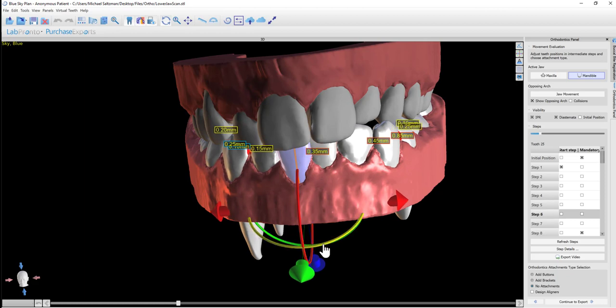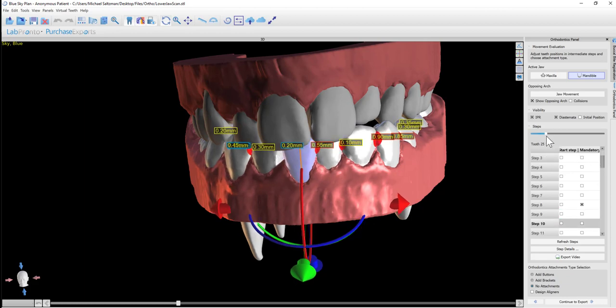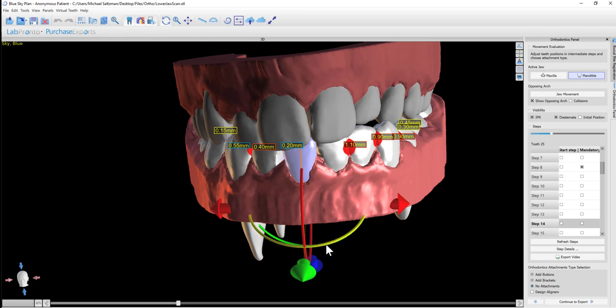So in step number 15, for example, if you want the tooth to be in a different position, then at step 15, as you see the different teeth movement, you could just go ahead and reposition the tooth at that step.